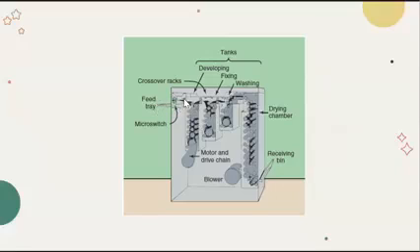So the film will enter here and then go down to the developer in the transport rollers, which are positioned in pairs or offset from each other. They are guided or propelled by the guide shoes until it reaches the turnaround assembly, which is composed of the master or solar roller and the planetary rollers. Your master roller allows the film to be transported 180 degrees back up, and then it encounters the crossover rack, which has squeegee rollers which squeeze the film, removing the excess chemicals from the film and lessening the carryover of the developer to the fixer.